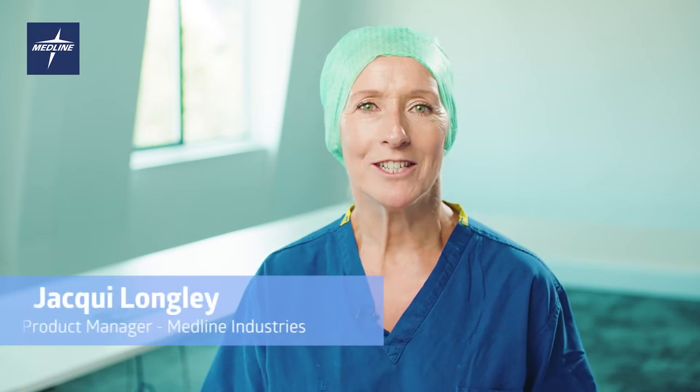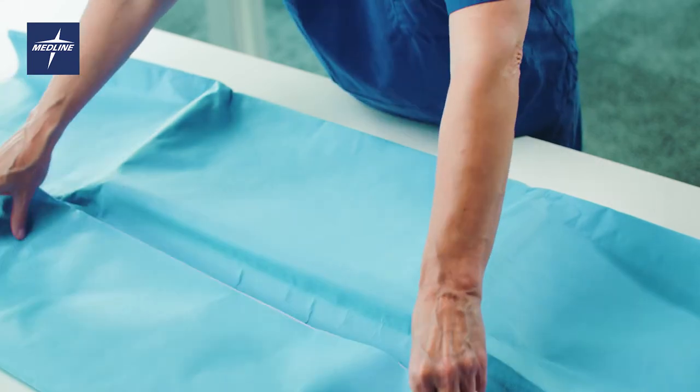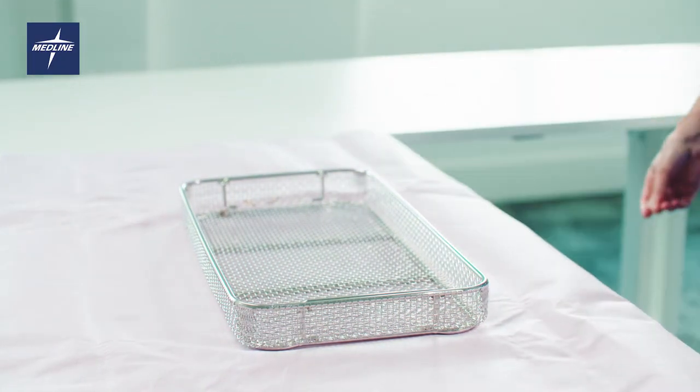My name is Jackie Longley, Product Manager from Medline. In this video I'm going to demonstrate how to aseptically open Gemini bonded sterilization wrap.